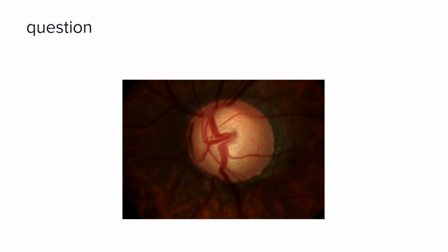And the cup disc ratio is around 0.6 to 0.7, ma'am. No, it's much more than that, no? Yes, ma'am, at least 0.8. What are the vascular changes you're seeing? Ma'am, nasalization of the vessels and peripapillary atrophy may be seen in all quadrants, and then the vessels are looping towards the center.